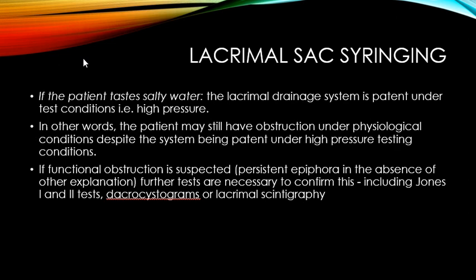Now coming to the interpretation of the lacrimal sac syringing. The possibility is the patient may tell they can feel some water in their throat, which means the drainage system is patent under the test conditions. That is, here you are injecting the fluid under high pressure.